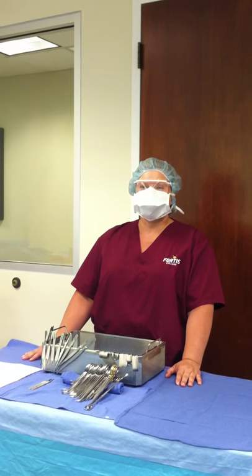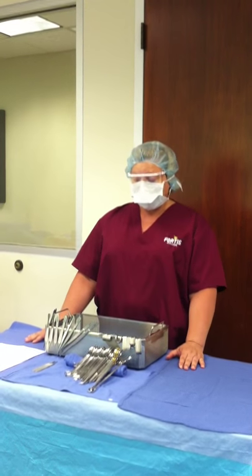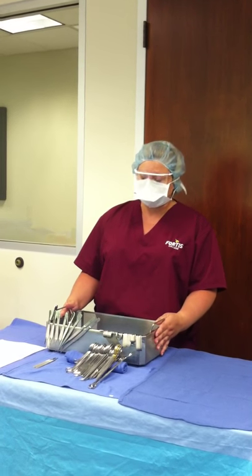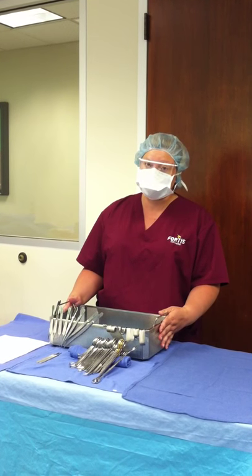Hello, this is Casey, mine is Michelle for the moment, and our beautiful camera person, Stephanie. Today we are here to show you how to put away your basic instrument tray. We have the minor, but this will do just fine because it's all pretty much the same steps.